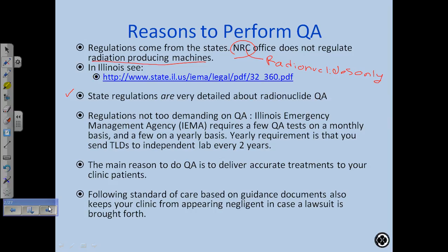And by the way, I just mentioned mammography units. Mammography units fall under the FDA. The FDA controls the regulations of mammography units under the MQSA Act. There's another set of regulations for mammography machines, so they have their own thing.